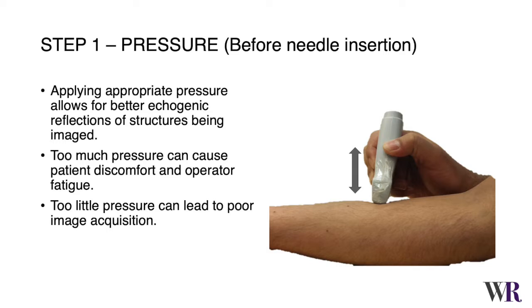Too much pressure application can lead to patient discomfort and operator fatigue. On the other hand, a smaller amount of application of pressure may not be sufficient.